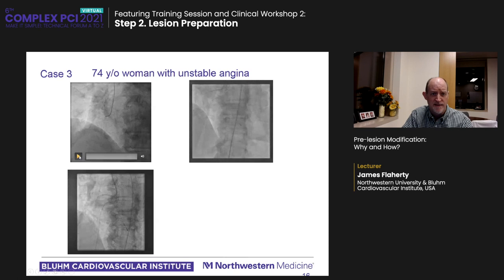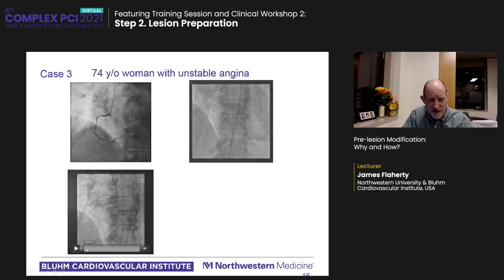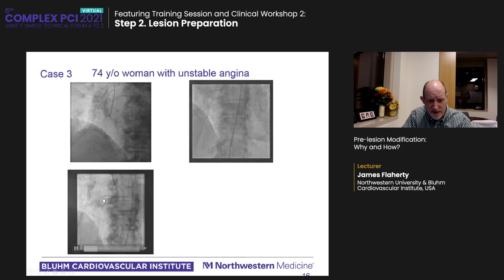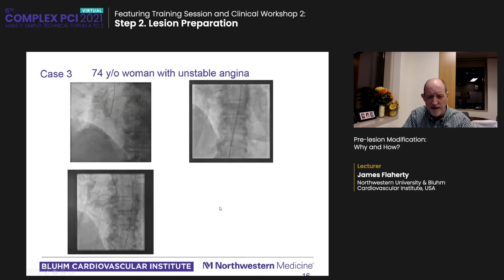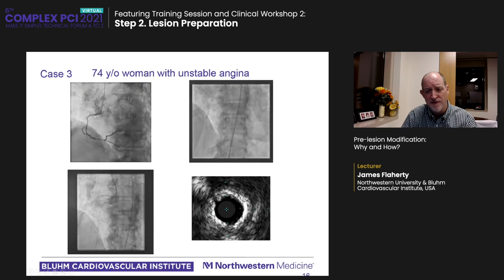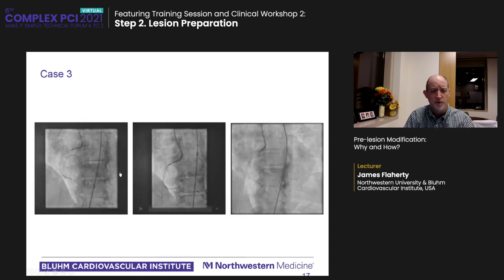Here's the third case, a 74-year-old woman with unstable angina, diffuse disease, and a tight calcified distal lesion. So the decision was made to do orbital atherectomy. There's the burr there. Then an NC balloon was taken, and maybe hard to see, but it just wouldn't expand. IVUS showed that there's still significant 360-degree calcium. So what do you do next?